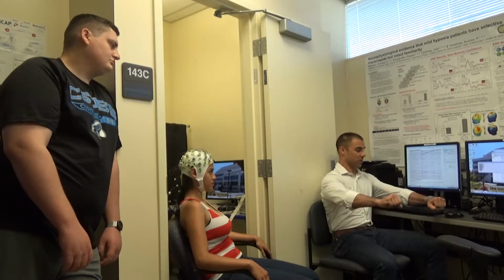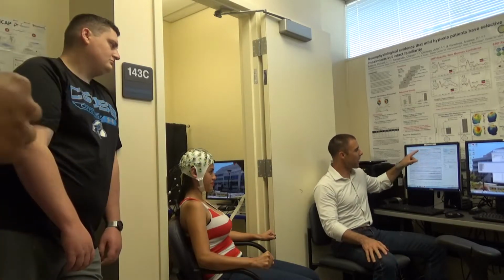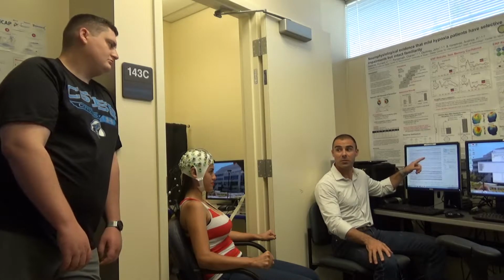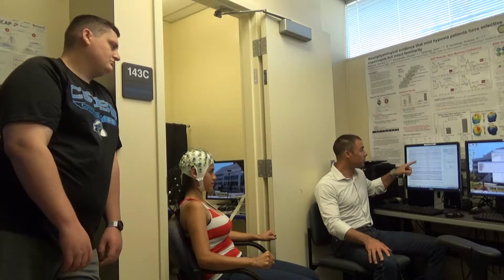So let's say you want them to stay really still, and you say, okay, I need you to stay really still. And they get real stiff, and they just try to freeze. Right, so do that. Look at the tension that's already there. Look at all this high frequency muscle activity, EMG. God bless you. Thank you. Can you see that all the way in the back, Brittany? That's not really what we want either, right?